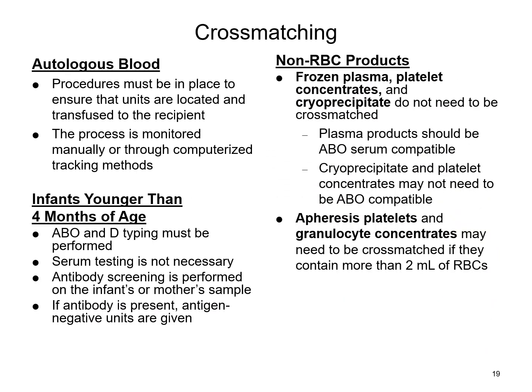So some additional scenarios could come up as far as trying to determine how to do the cross-matching, and these particular scenarios would include autologous blood. The facility that you're at should have some sort of policies and procedures in place, even stating whether they're actually going to allow any sort of autologous donations at that facility, and then what to do with it beyond that point.